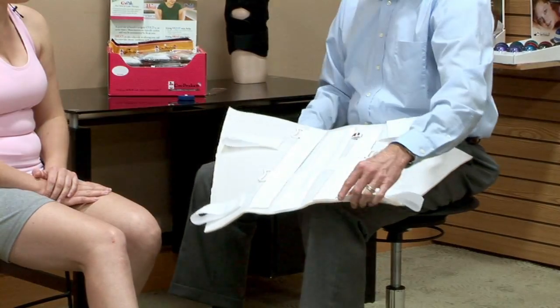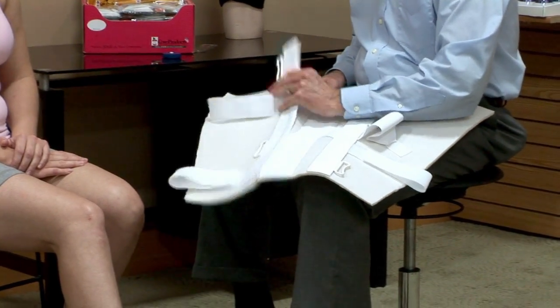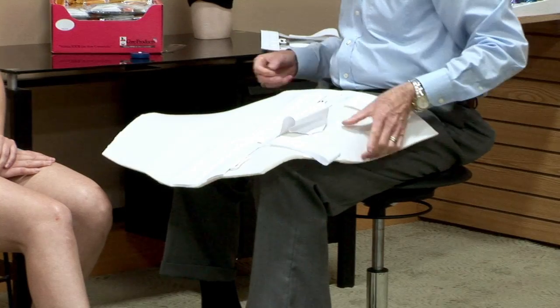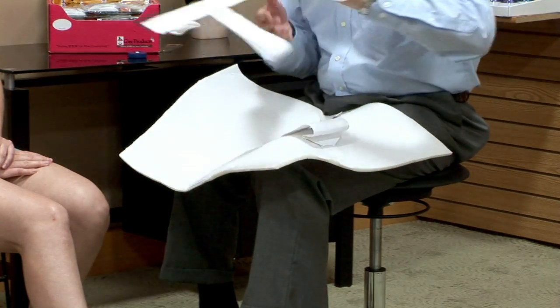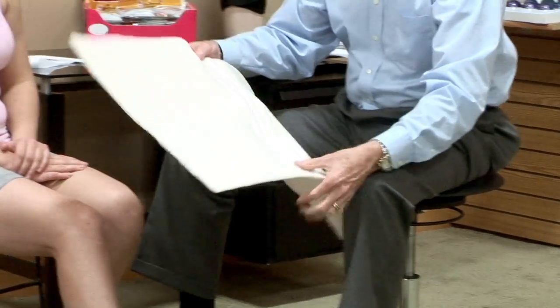To fit one of these, I'm going to take the sidebars off and remove them, because they will be customized to the patient's leg. Now I can put this on the extremity.